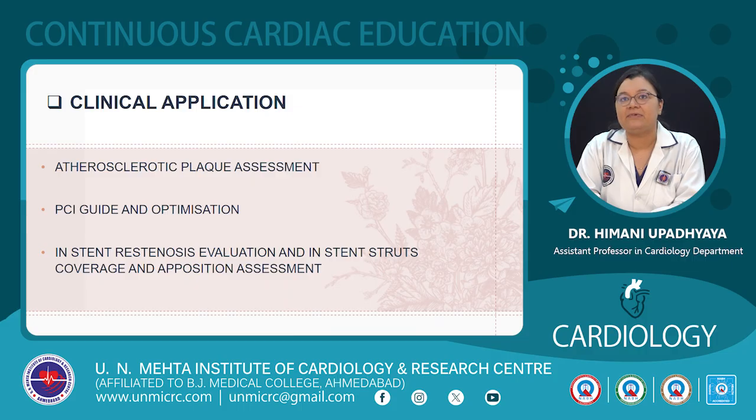The clinical applications of OCT are mainly atherosclerotic plaque assessment during PCI and stent optimization, in-stent restenosis evaluation, and in-stent strut coverage and apposition assessment.